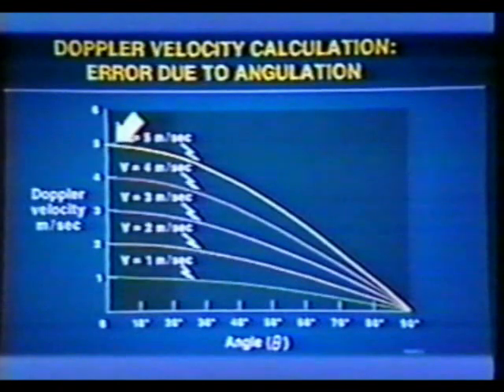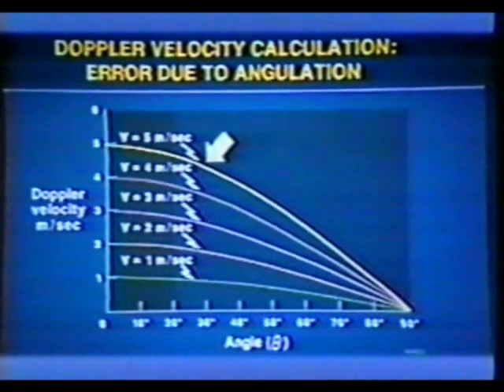As you can see, when theta increases beyond about 20 degrees, an unacceptable underestimate of the velocity occurs. And this error will be reflected in other measurements, such as cardiac output. Fortunately, in most clinical situations, we are able to find an ultrasonic window that will allow us to orient our sound beam axis directly along the major blood flow axis.